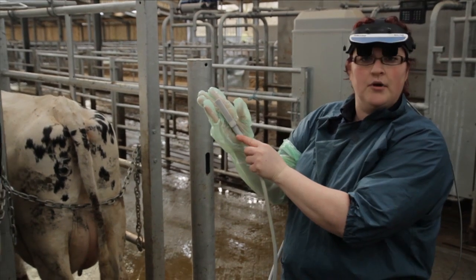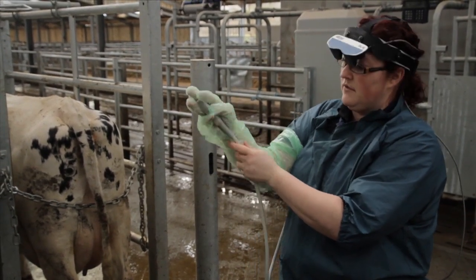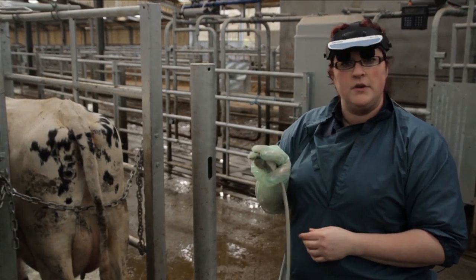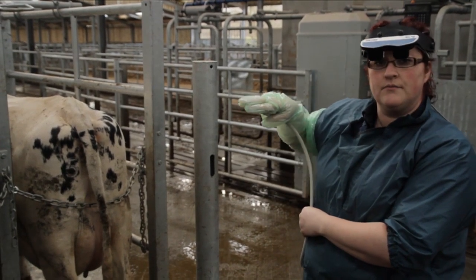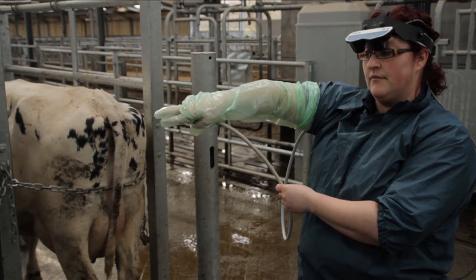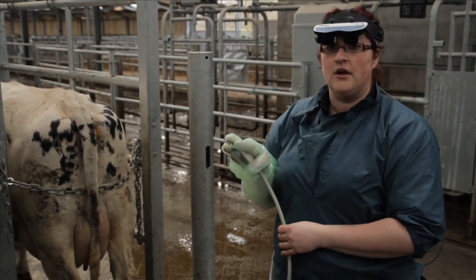So again, palm the probe, finger on the leading edge, have your other 3 fingers on either side, and use your thumb as a backstop. The movements that we can make are move forward or back, pressure, rotating side to side, and rocking or tilting. Now we're ready to go inside the cow.